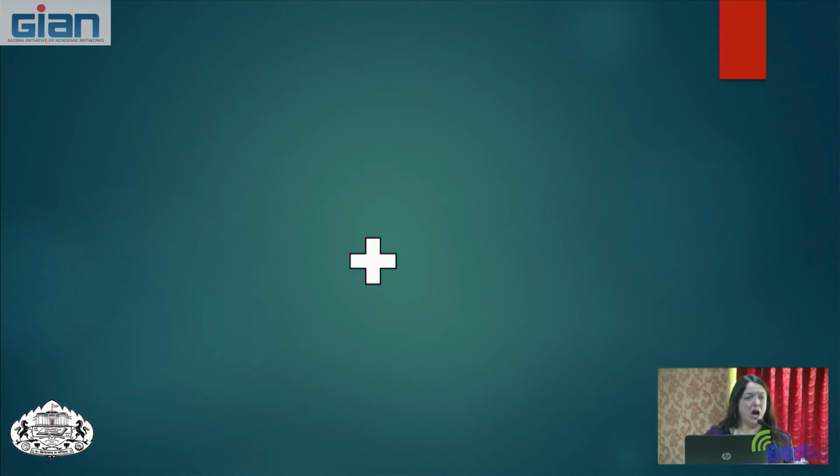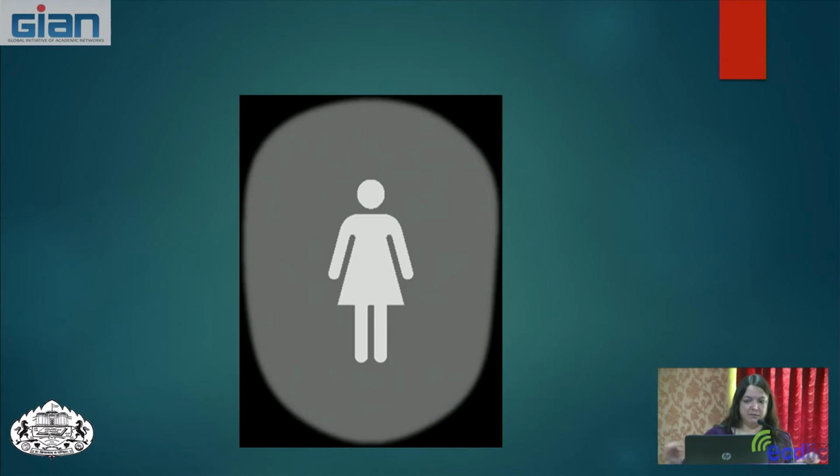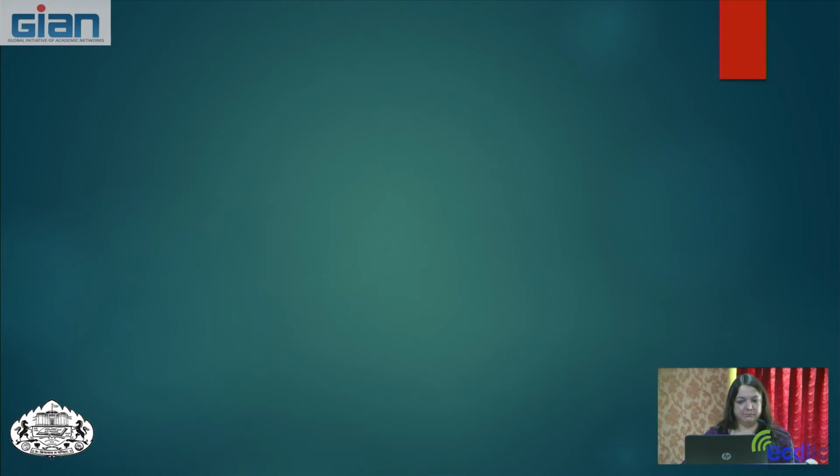Okay, so here would be our control condition. So in this case, you can see that the difference in our tasks here would be the looking at the anger emotion versus looking at a control figure, okay? So we're hoping to get the implicit emotional processing. So this person is processing emotions and they don't even know it. But in fact, some of these faces look a little comical and people think they're a little silly after they've been looking at them for a while.